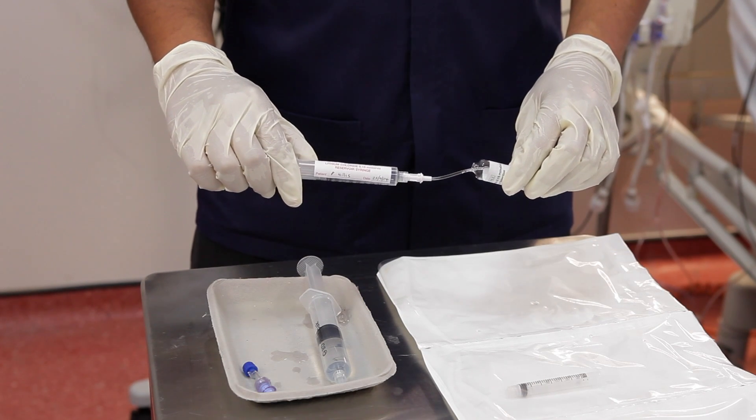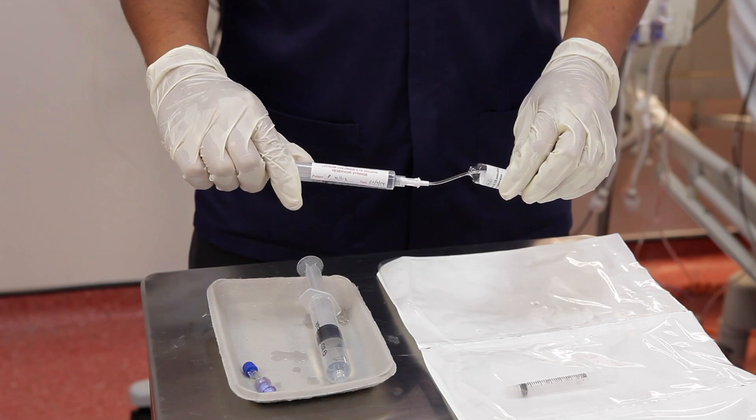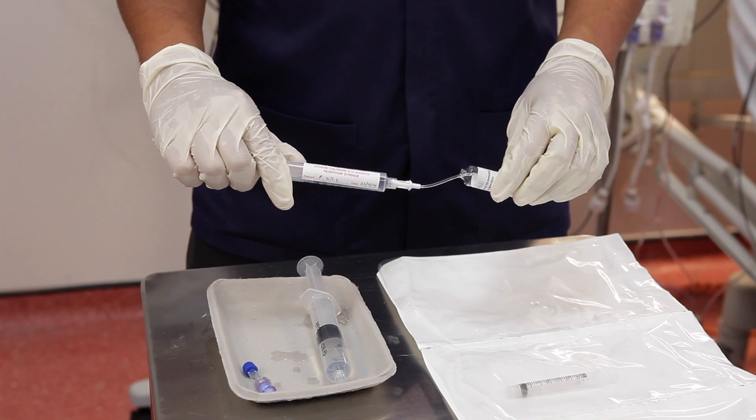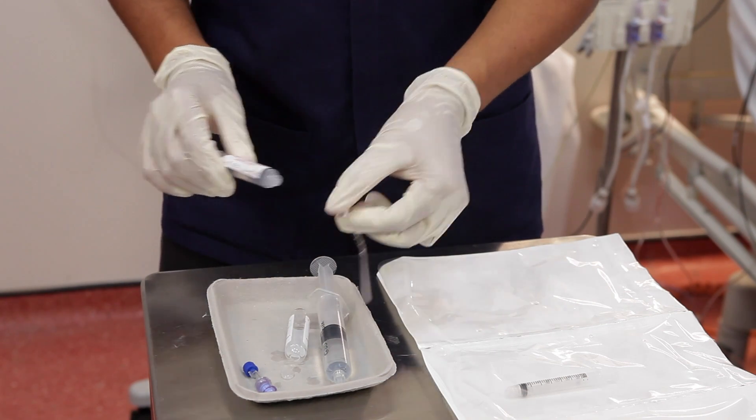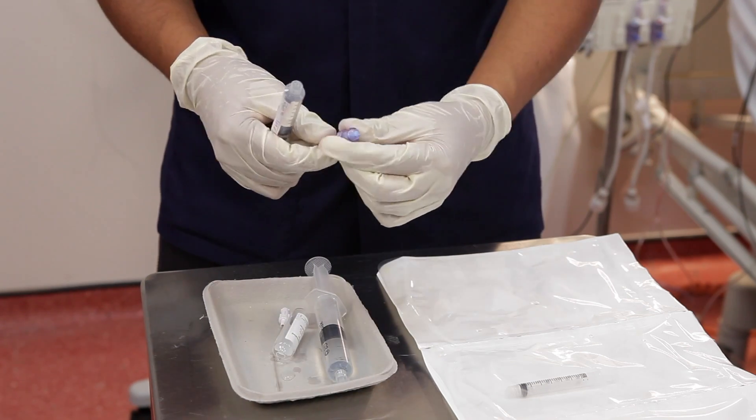Next, take your lithium chloride ampoule and draw up the full amount using the 10ml syringe and quill. Connect the needle-free valve and label the syringe.